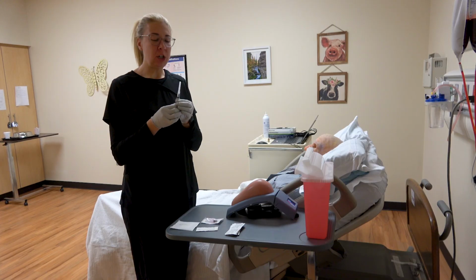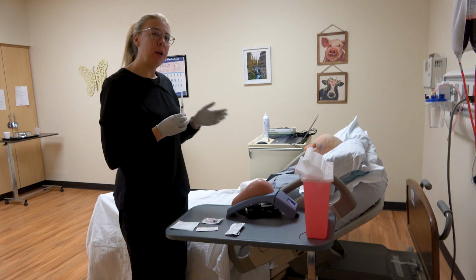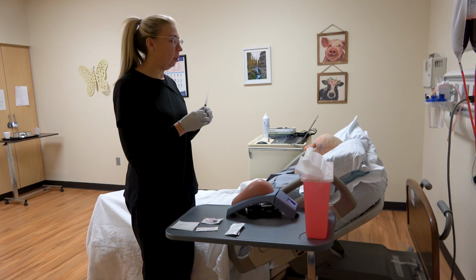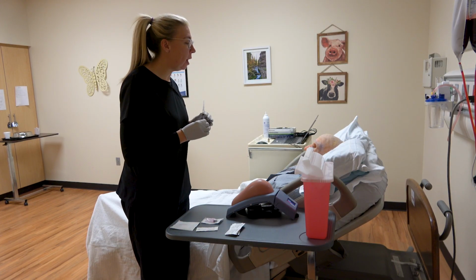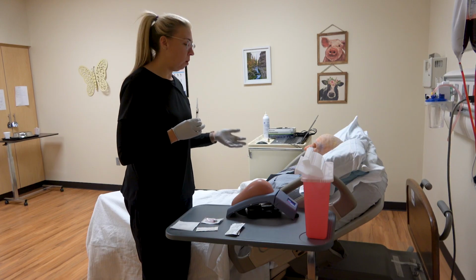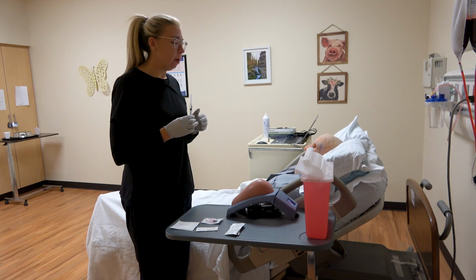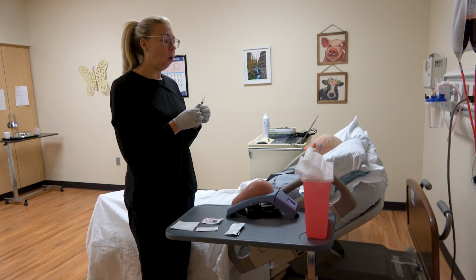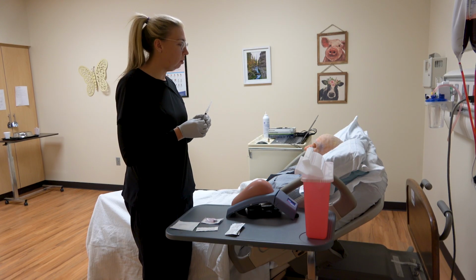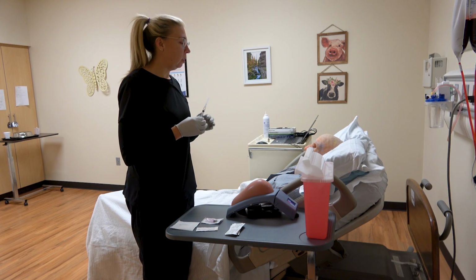Okay, so we have our medication. I'm going to verify with our patient that he does not have any allergies, especially to the medication that we are giving him. So, Mr. Smith, do you have any allergies? No known allergies. Perfect. I'm also going to educate the patient on this medication. So right now we're giving Toradol, which is for pain control. So what would you rate your pain right now? An 8 out of 10. Okay, so we're going to go ahead and give this medication. It goes into a muscle.